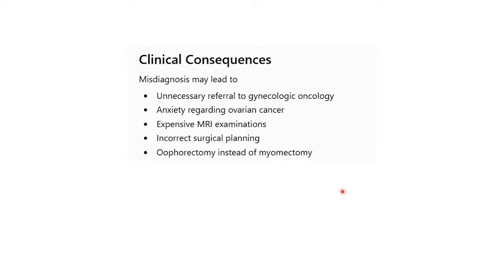So now, what are the clinical consequences of this mishap? Misdiagnosis may lead to unnecessary referral to a gynecological oncologist, anxiety regarding ovarian cancer, expensive MRI examinations, incorrect surgical planning, oophorectomy instead of myomectomy. So you see now how a misdiagnosis can cause mismanagement of the patient or extra expenses which are not necessary for the patient.